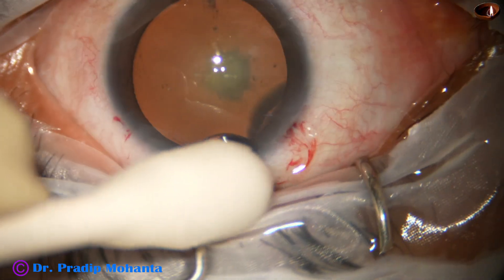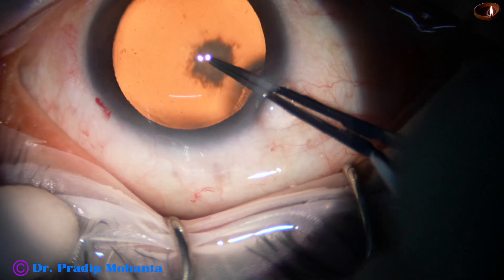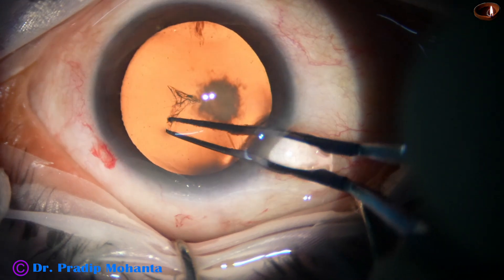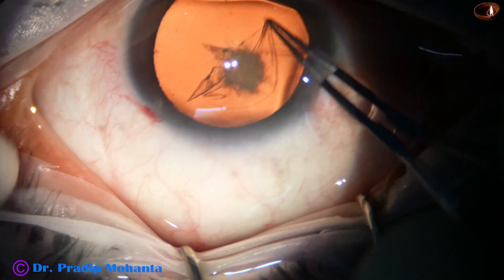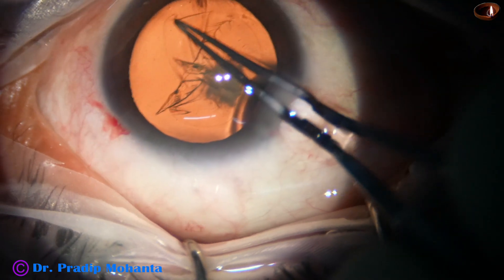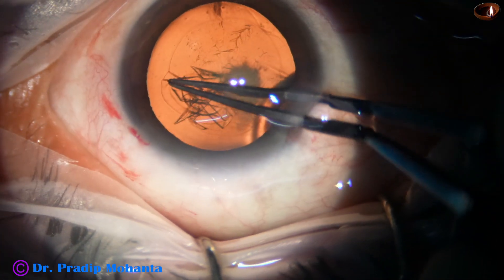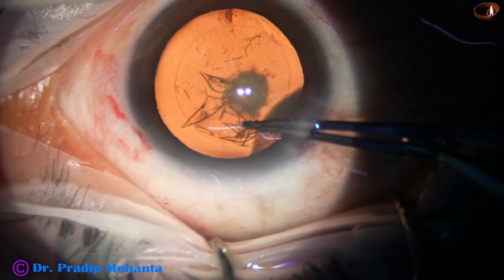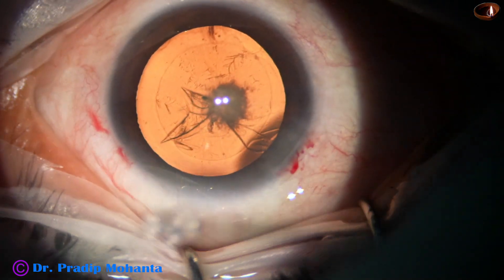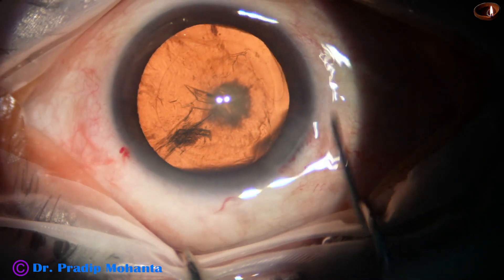Dear colleagues, in this video I am going to show capsulorhexis, pre-chop, and cortical cleanup in four cases. This is the first case — capsulorhexis is being done by the utrata forceps. This is a real-time video clip. You can see the rhexis size is about 5.25 millimeters. Hydrodissection is done.